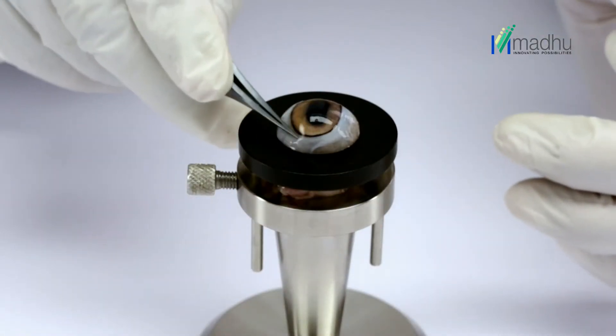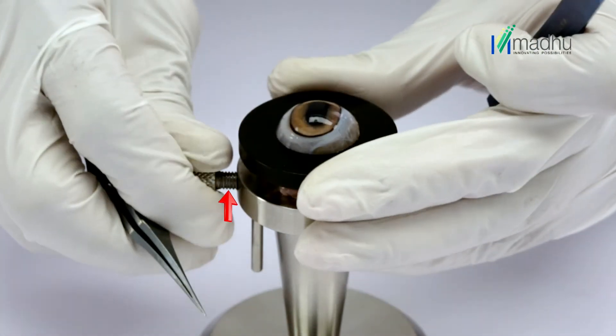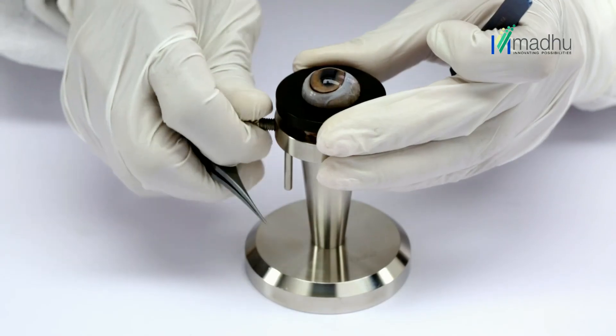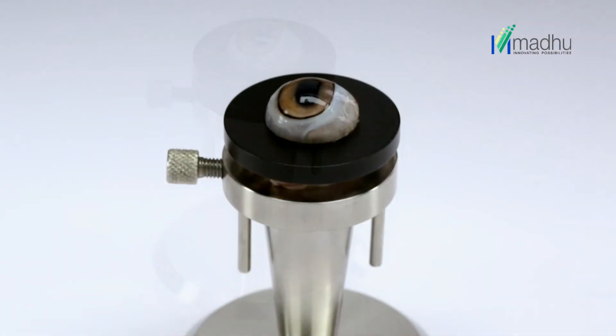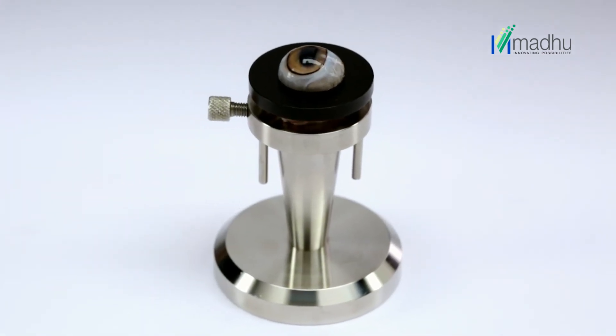If adequate pressure is not achieved, unscrew the lock and press the top fixation ring further down to increase the pressure. Once adequate pressure is achieved, tighten the screw to hold the animal eye firmly in place.